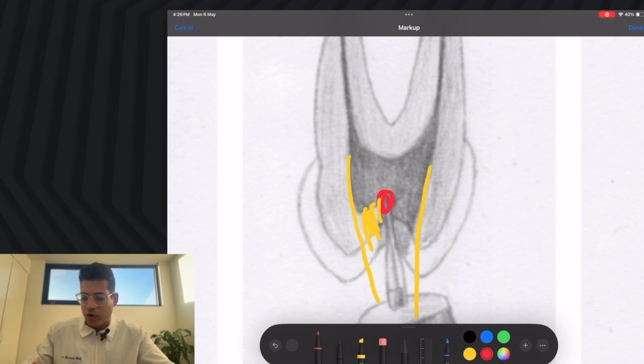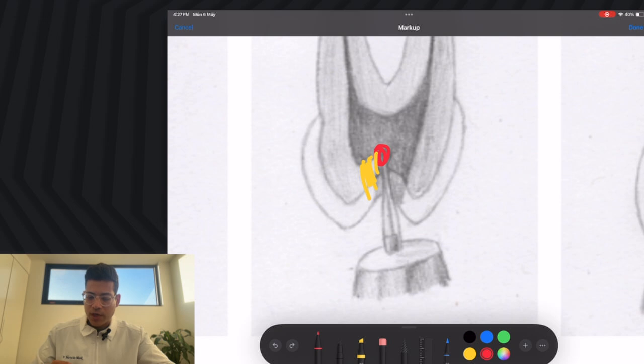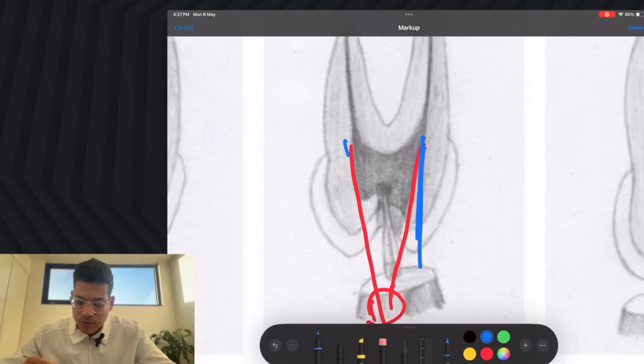So when you look from an occlusal view right there, you could see the canal orifice. Now the problem is we've been taught to be so conservative that by the time we get that outline from the top, it's so narrow that you can't even see it. That's the problem: there's a high indication that you might have left a roof there. That is why it's so important to clean this up a bit more so you can start to visualize it better.